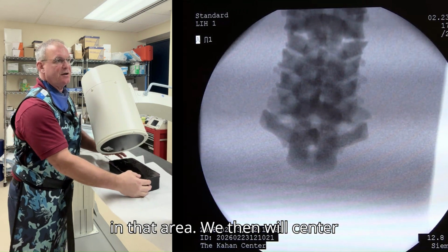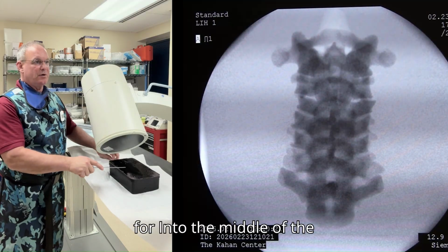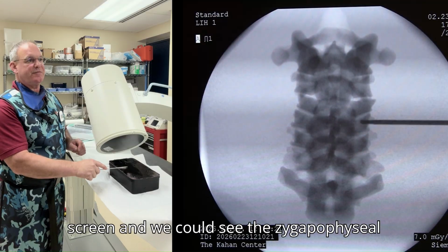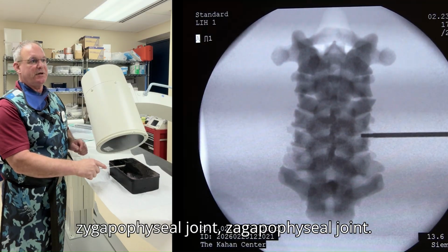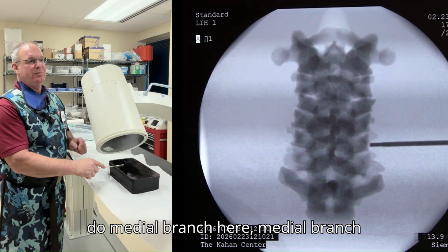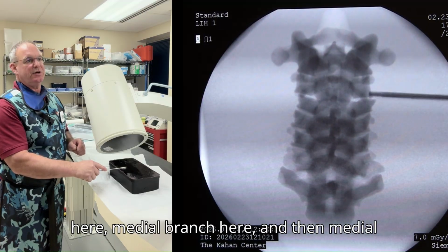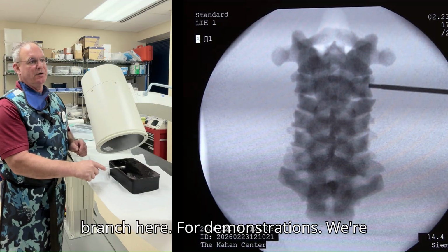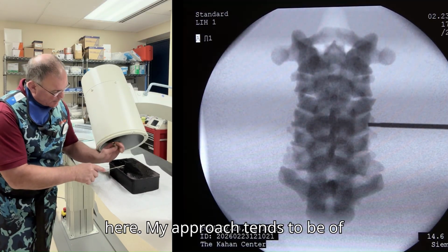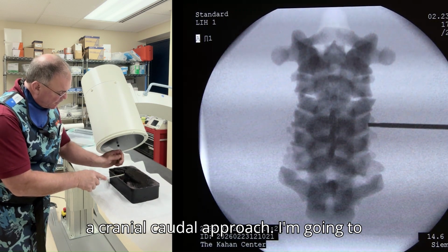And what we can see here is our joint lines are starting to line up in that area. We then will center the joints that we want to go for into the middle of the screen. And we could see zygapophyseal joint, zygapophyseal joint, zygapophyseal joint, zygapophyseal joint. So right in this view, I could do medial branch here, medial branch here, medial branch here, and then medial branch here. For demonstrations, we're just going to pick this area right here.